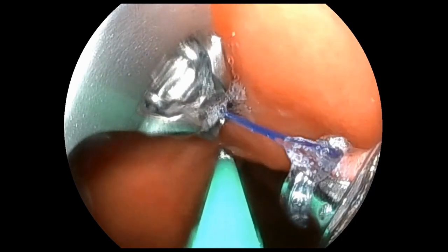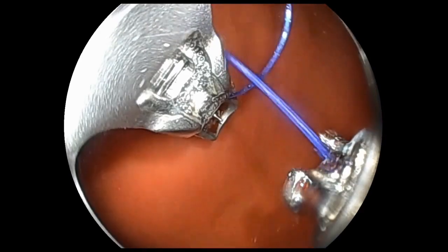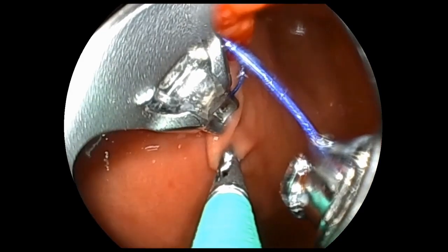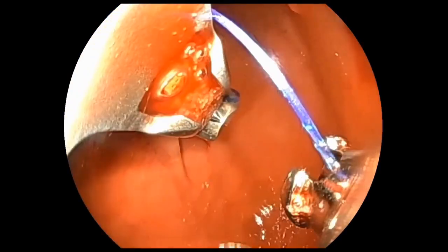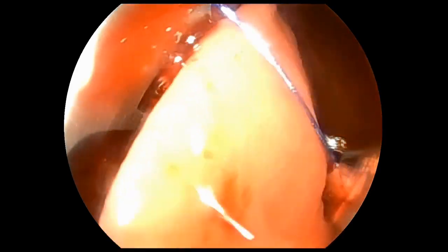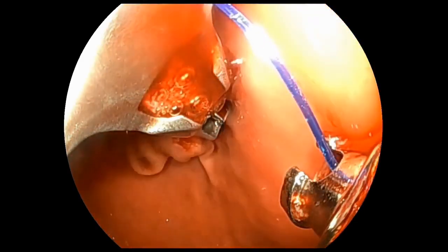The ESG procedure commences at the level of the incisura. The mucosa is firmly grasped and pulled toward the endoscope, allowing for full-thickness suture placement. This process is repeated every 0.5 to 1 cm from the anterior to posterior aspects of the greater curve. Note that care is taken to always open and close the grasping forceps beyond the suturing system, to avoid entrapping the grasper within the suturing tower. The needle is driven perpendicular to the gastric tissue, ensuring a full-thickness bite.